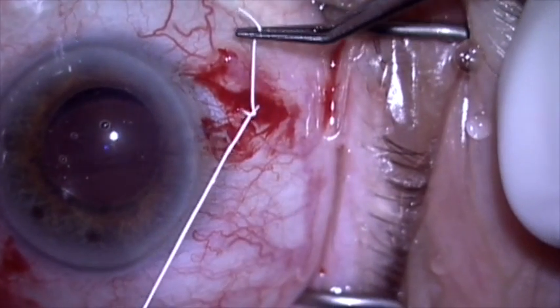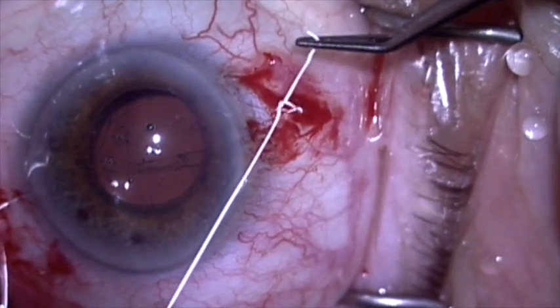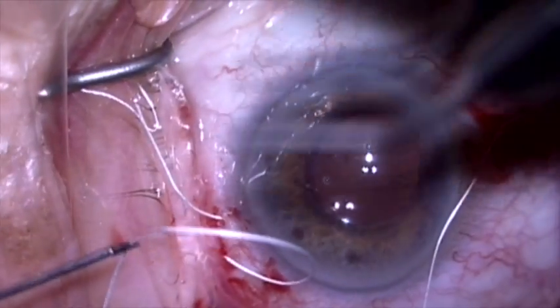Here we're going to tie it on each side. I'm going to do a slipknot — I'm passing two throws in the same direction, and this will not lock. This means I can tighten and loosen this, and I'm going to do the same thing on the other side.